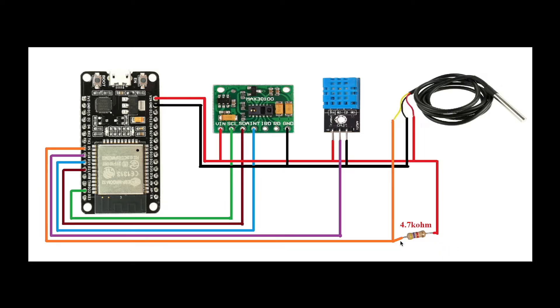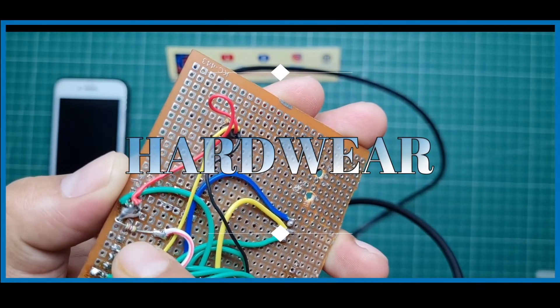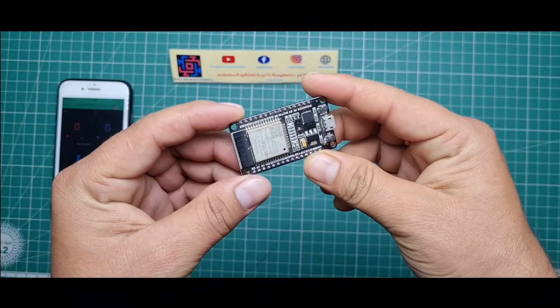This is the whole circuit diagram. If you want the circuit diagram, please visit my website where it is available. Now let's go and see the hardware of this project.